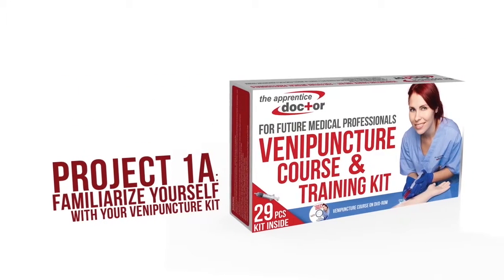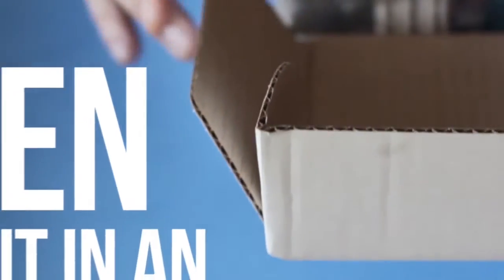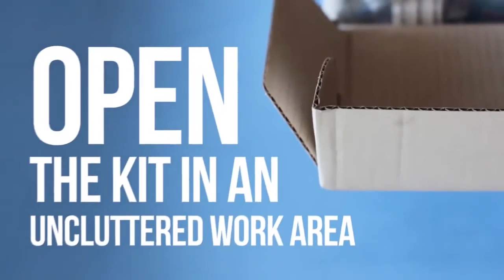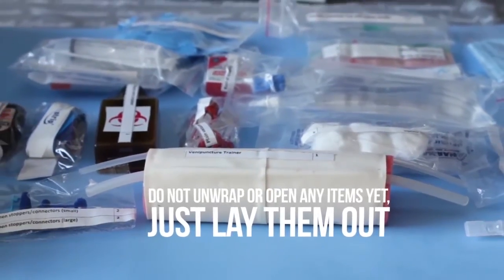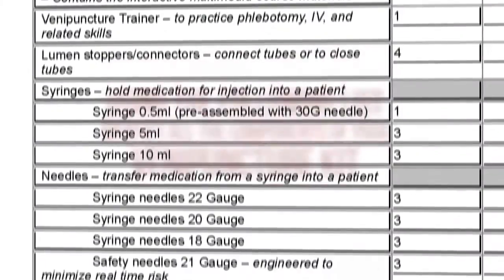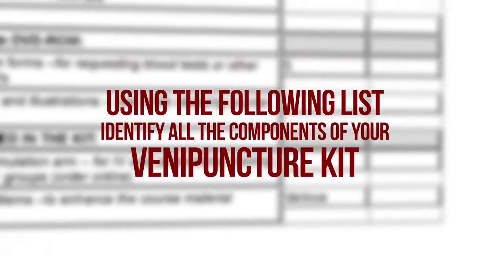Project 1A: familiarize yourself with your venipuncture kit. Open the kit in an uncluttered work area. Do not unwrap or open any items yet, just lay them out. Using the following list, identify all the components of your venipuncture kit.